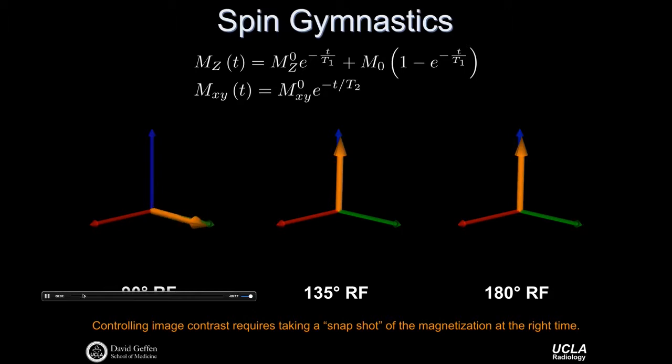And at this point in time, the RF pulse is turned off because the bulk magnetization has reached the position that we care about, that is, lying in the transverse plane. And that's a process of forced precession. The RF pulse forces the magnetization into that state. Now, because the RF pulse is turned off, we enter into a period of free precession.